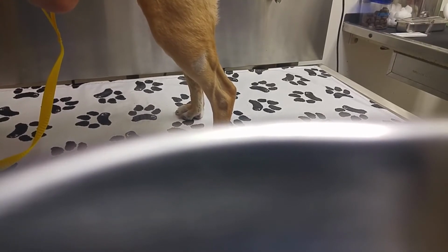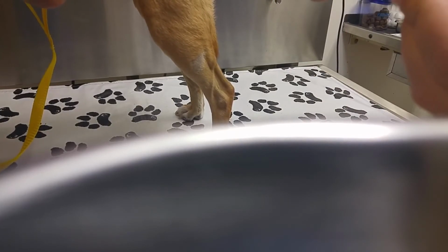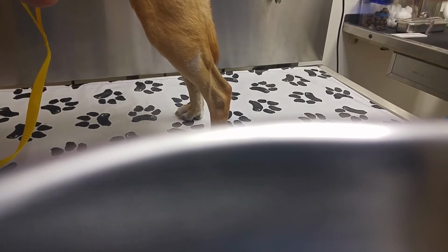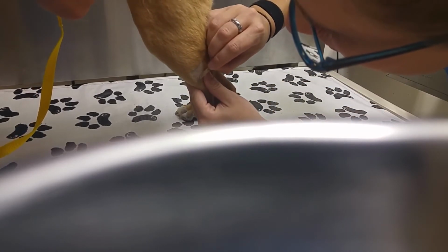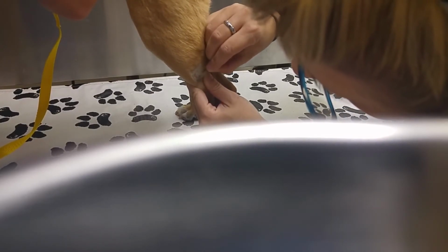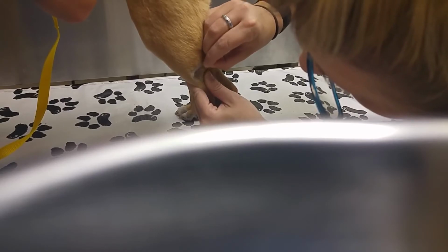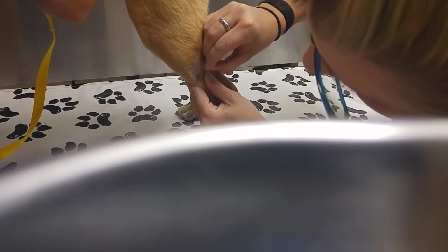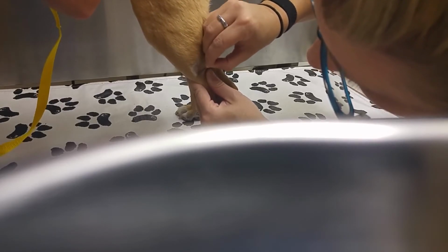So I have a slide here with mineral oil. I'm going to take my blade and dab it in there just a little bit. And I'm going to go in a perpendicular fashion to the skin and just scrape, careful not to make an actual incision. Since you're just looking for mites, I'm going to scrape until I see some of the capillary beds appear. And I'm starting to see some.